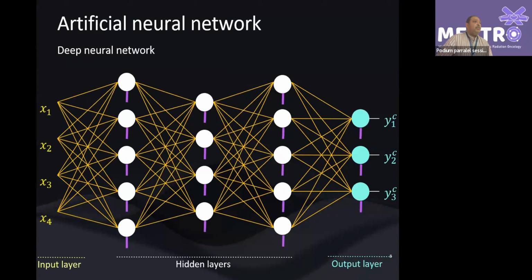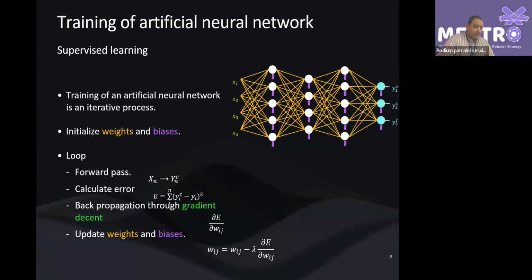So this is what a neural network looks like. We use neurons to structure an artificial neural network where we have inputs here. These are usually called features in the terminology of data scientists. We pass these features and get some output here, and then we compare these outputs to a reference set of known things. These are called labels in the terminology of data.